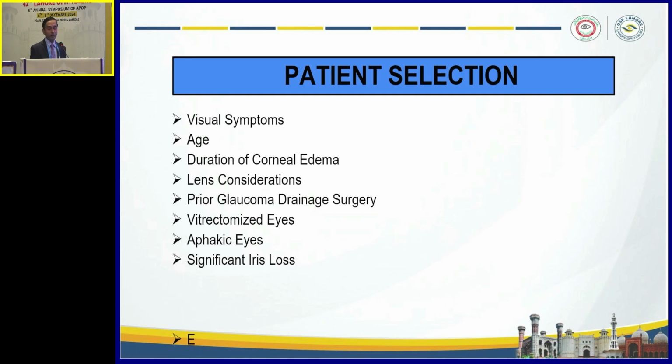Visual acuity and recovery take longer in prolonged corneal edema, hence it is suggested that the patient should be counseled beforehand. DSAEK typically causes a hypermetropic shift of 0.75 to 1.5 diopter, hence adjust for the above in IOL calculation if you are planning a triple procedure.